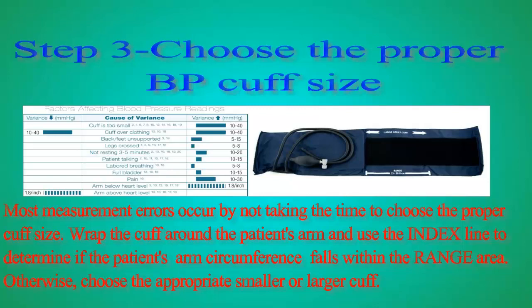Step 3: Choose the proper BP cuff size. Most measurement errors occur by not taking the time to choose the proper cuff size. Wrap the cuff around the patient's arm and use the index line to determine if the patient's arm circumference falls within the range area. Otherwise, choose the appropriate smaller or larger cuff.